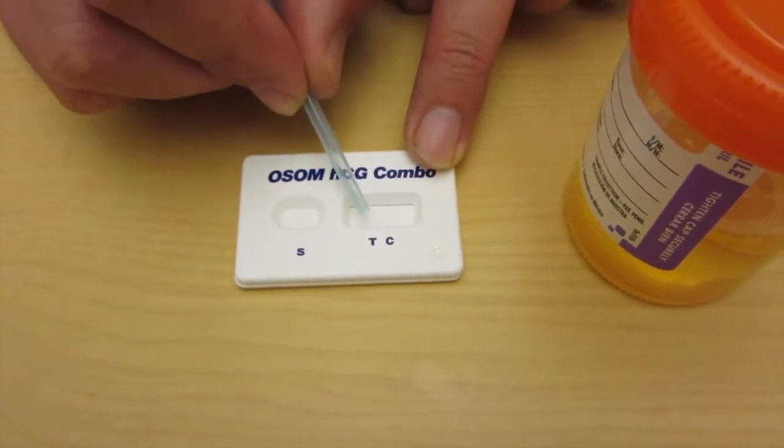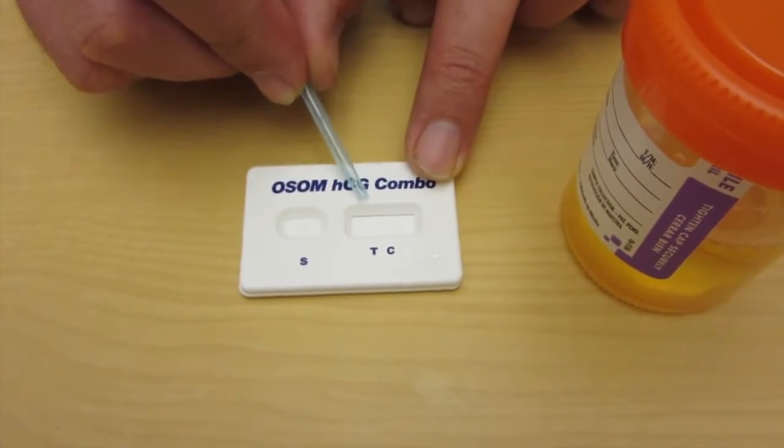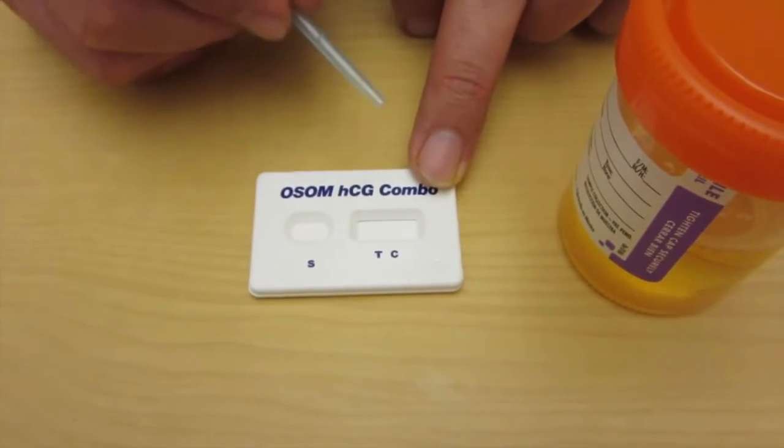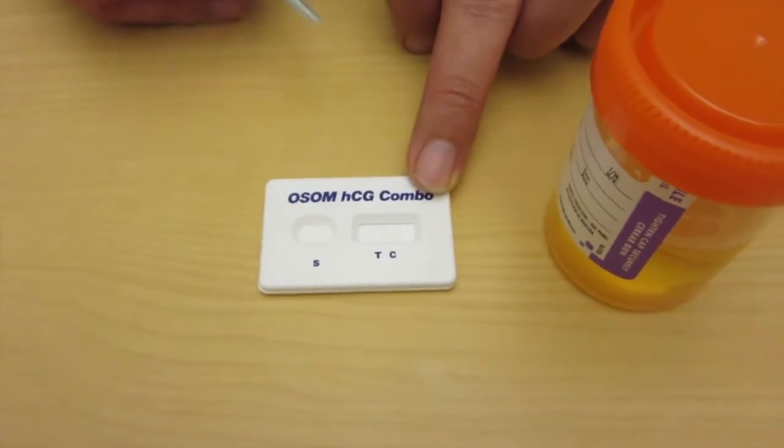If you have a line here, you're pregnant. If you don't have a line here, you're not pregnant. If the line is really faint, consider retesting it within 48 to 72 hours or doing a blood HCG called a quantitative serum HCG.